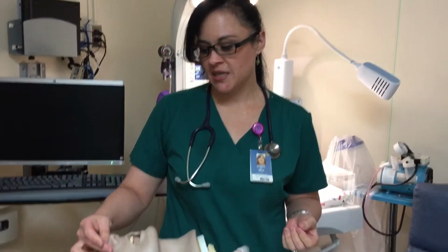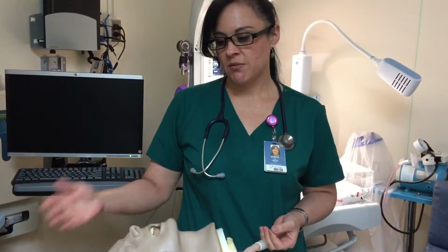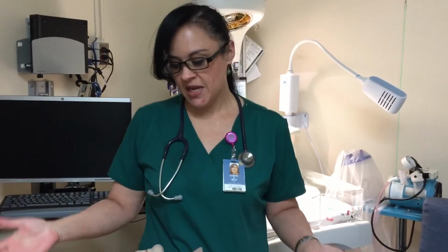Thank you. And to finalize this BiPAP presentation, just want to remind you all of our documentation requirements. So every 4 hours when we do our BiPAP inspection, we're going to be documenting the skin assessment, what we found. We're going to be documenting the barrier devices that we're using, and then the action plan that we took. For example, we had the Mepilex, and then we graduated to the Gecko. You would say graduated to Gecko. If the same continuous care continues, you would say usual care will continue.